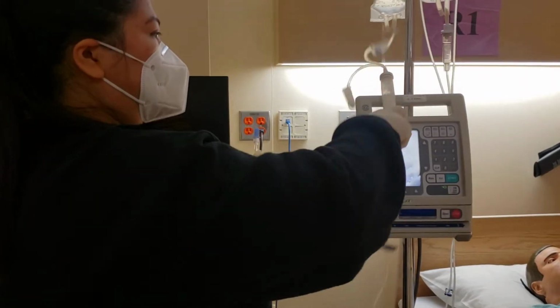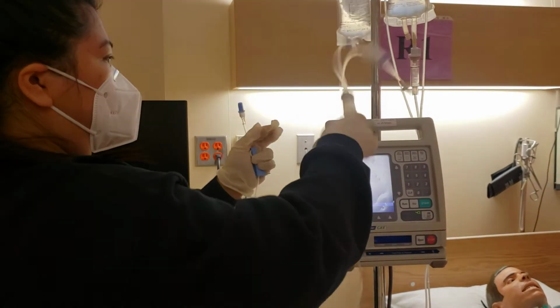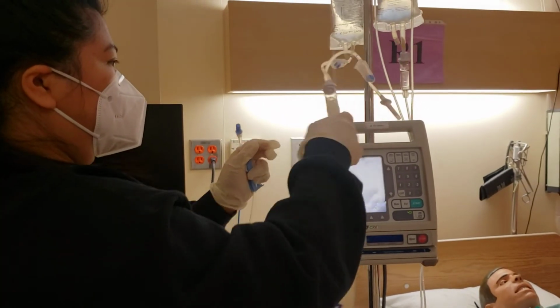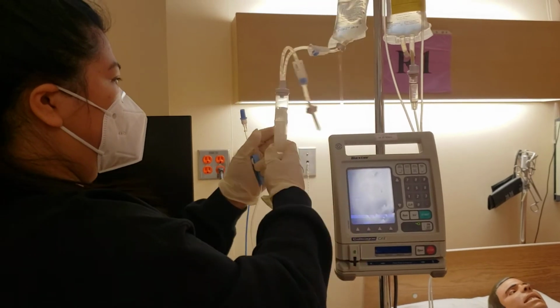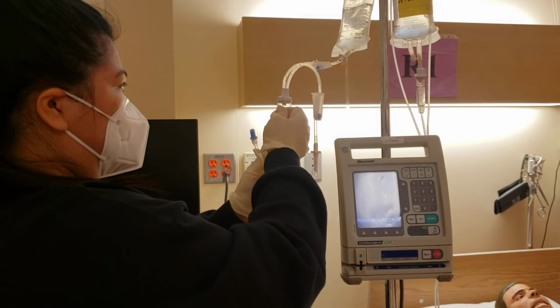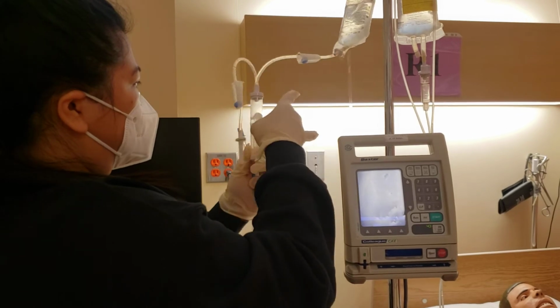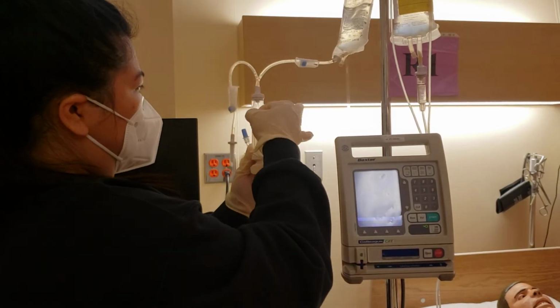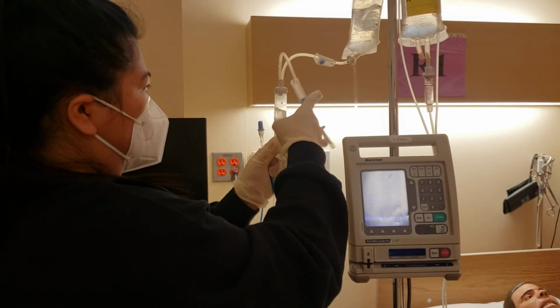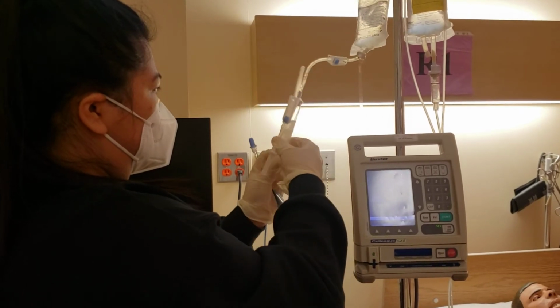So I have here my 100 units per ml vial of insulin, and I drew up 1 ml of insulin from that vial. I also have here my diluent of 100 ml normal saline. As you can see on our final med label, we have 100 ml normal saline. The dose is 100 units, and then we drew up 1 ml of insulin, sorry.